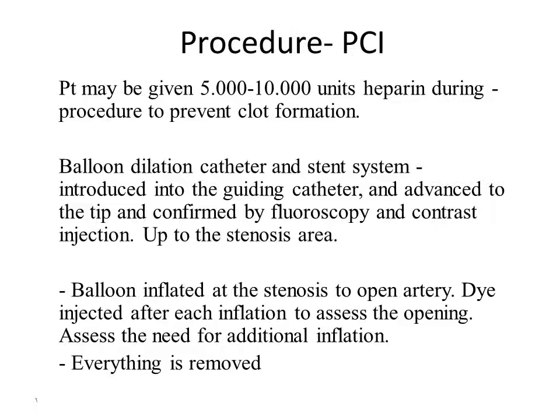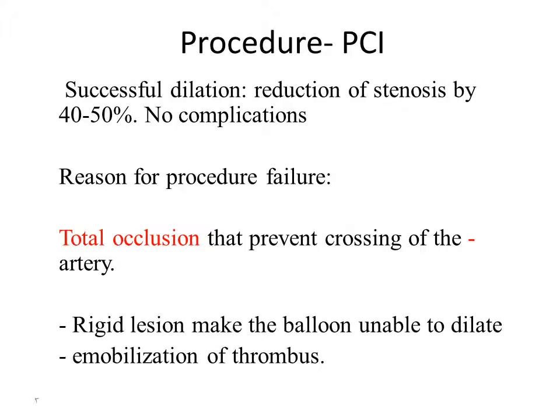This is an important point, that the dye is injected after each inflation to assess the opening, assess the need for additional inflation, and everything is removed after the completion of the procedure. Successful dilation means reduction of stenosis by 40 to 50% without complication.